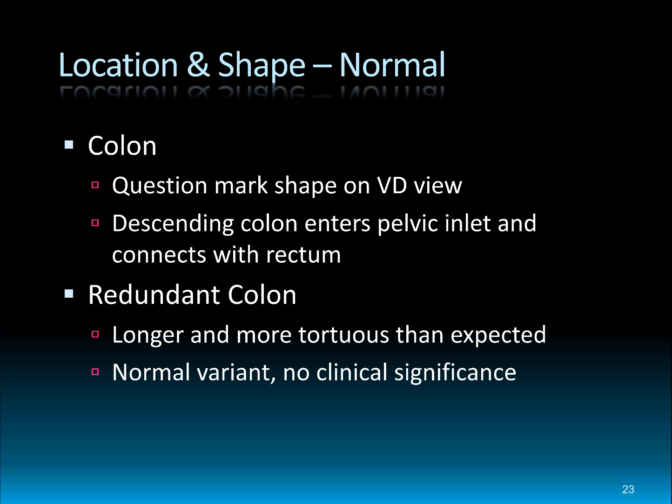The colon broadly has the shape of a question mark on the VD view, although we saw with that redundant colon that's not 100% true. And then the descending colon enters the pelvic inlet where it connects with or turns into the rectum. Again, redundant colon is when the colon's longer than it needs to be, but it really has no clinical consequence.